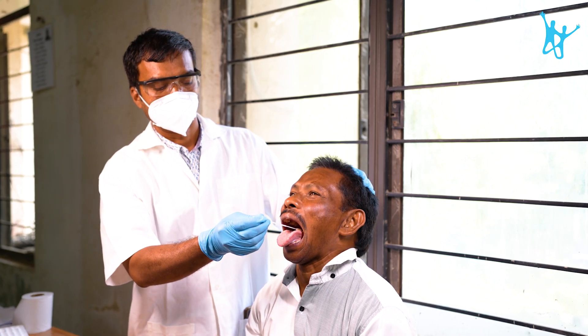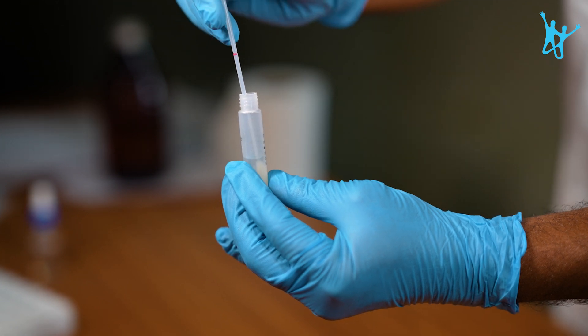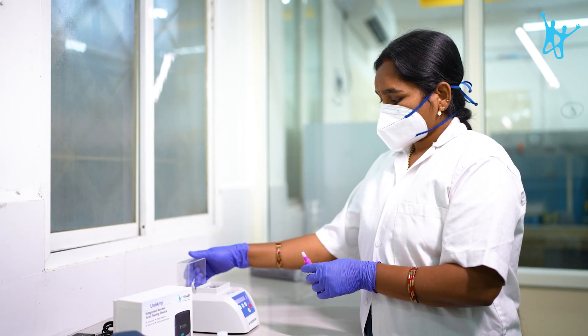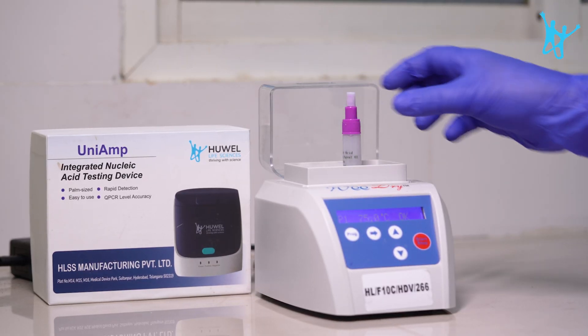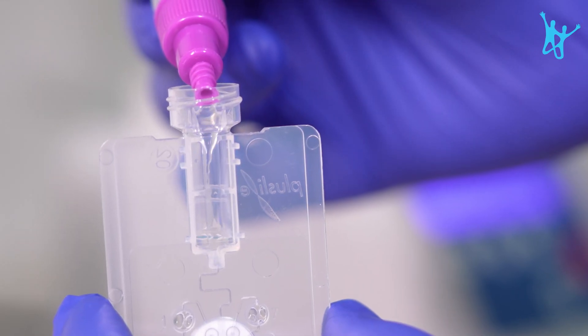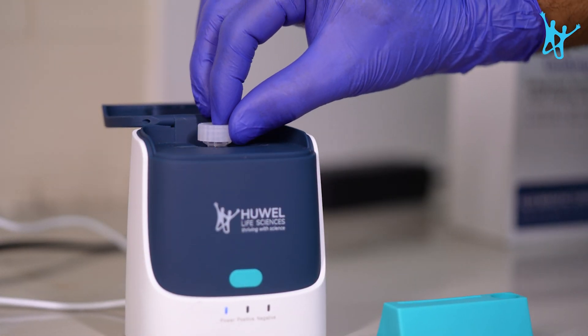The technician collects a sample from the patient. The swab is placed in a tube containing reagent and then in the incubator device for testing. It is incubated at 75 degrees Celsius for 10 minutes. The lysed sample is added to a cartridge after incubation, and the cartridge is inserted into the device to run the test.